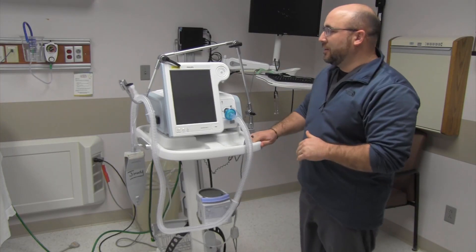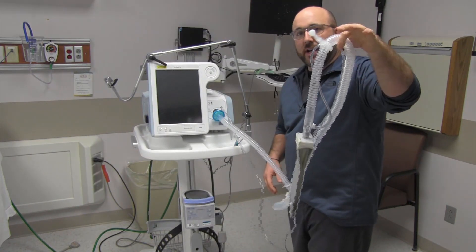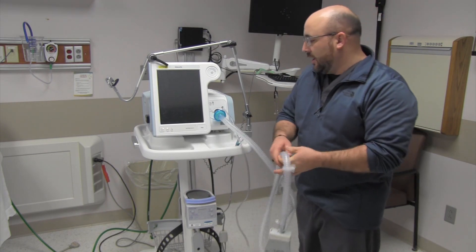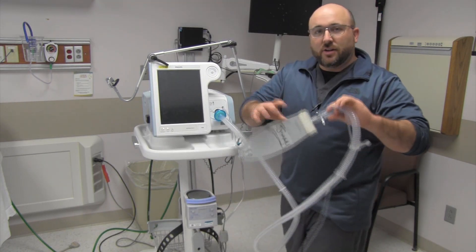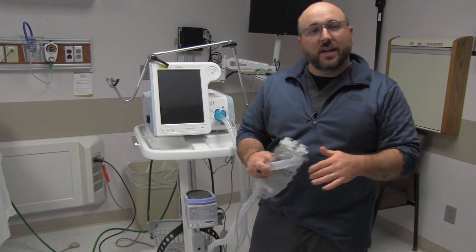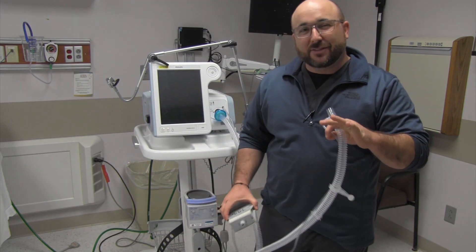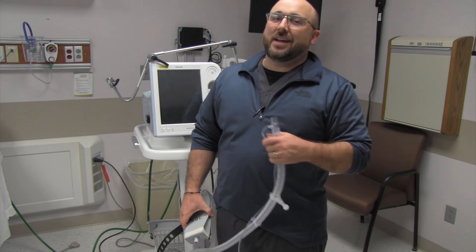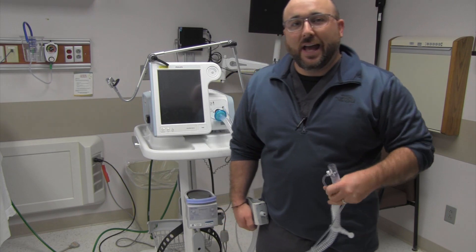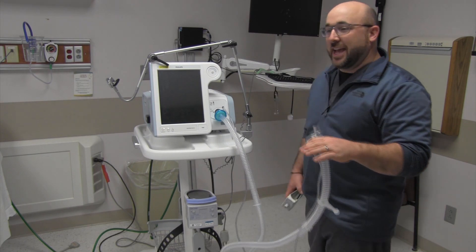You're used to seeing our standard V60 setup like this — we have a single limb circuit coming from the machine, usually going through a heater. It goes out and you can attach it to a mask; we can run ST, CPAP, PCV, AVAPS, whatever you want on our patient. We've done that a lot through this COVID-19 pandemic, and oxygenation has been at a premium.